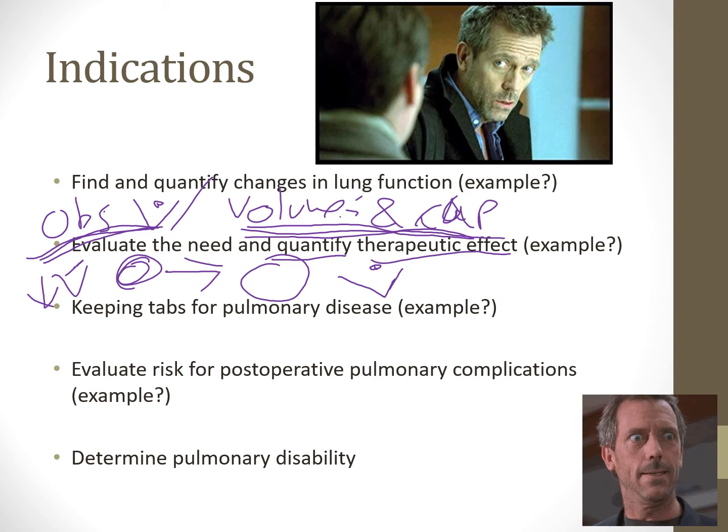Hopefully it's at least a 12% change from before. So we're going to measure it before we give them the bronchodilator, then give them the bronchodilator, wait 10-15 minutes, and then measure the test again and see if their flow rate did improve and how much it did improve.